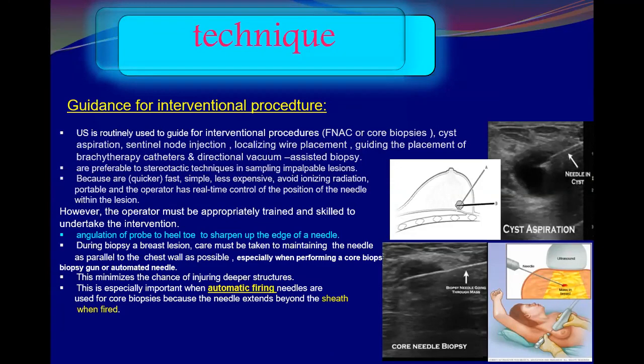Why is it preferable over the stereotactic technique? Because it is quicker, simple, less expensive, avoids radiation, portable, and gives real time control of the needle. But it needs skills and training for doing the interventions.